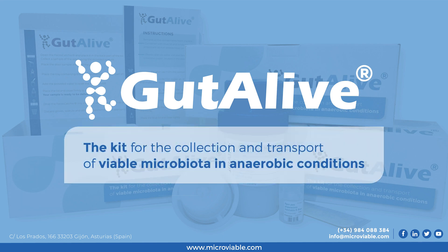GutAlive is a commercial kit for collecting and transporting biological samples under anaerobic conditions.